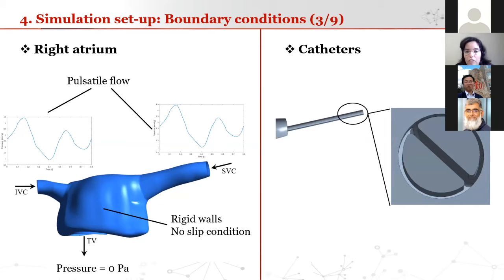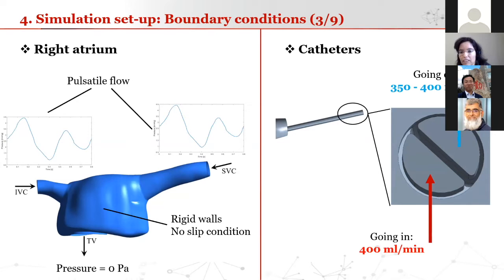And then to insert the catheters, the same conditions were used for the right atrium. And for the catheters, we employed inflow and outflow within clinical guidelines.